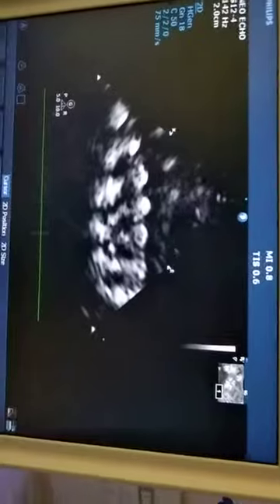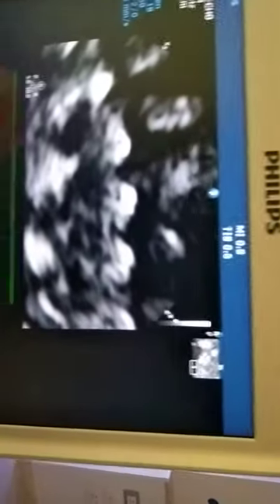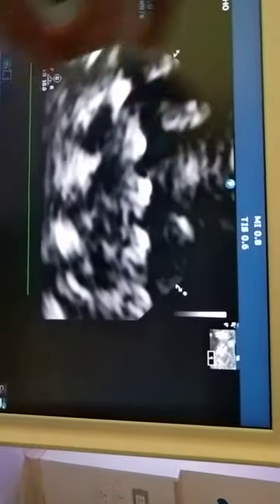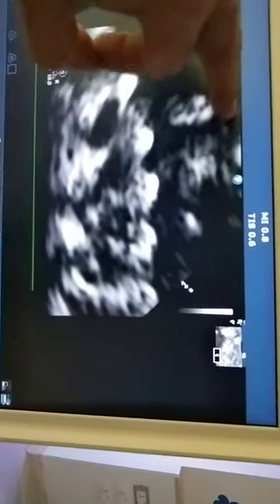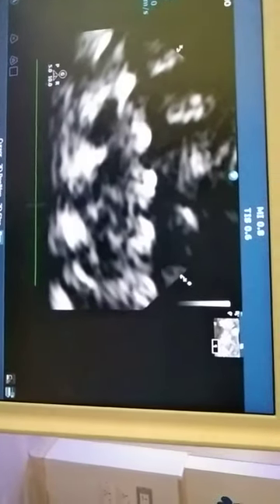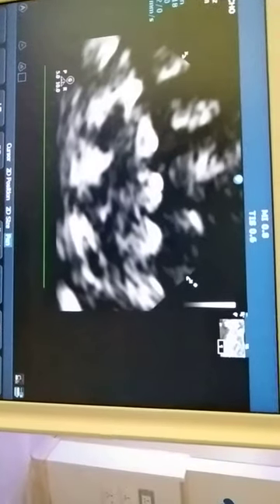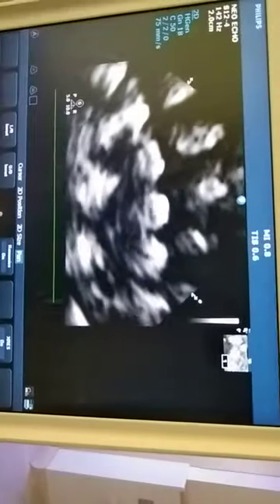You can appreciate that — you can see this is the vertebra, and anterior to the vertebra the tube is moving. That is the esophagus. What you see anterior to the vertebra is the esophagus, and I just asked him to do in-and-out movement. The tube is just anterior to the vertebra and it is in the esophagus.